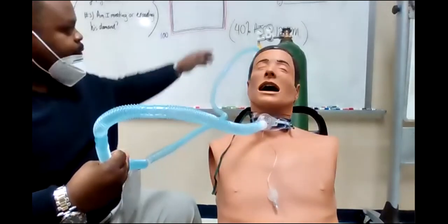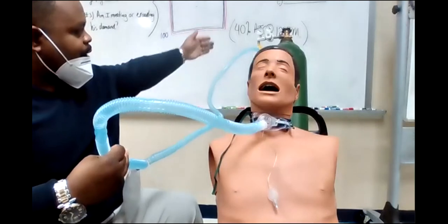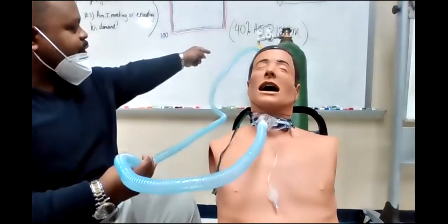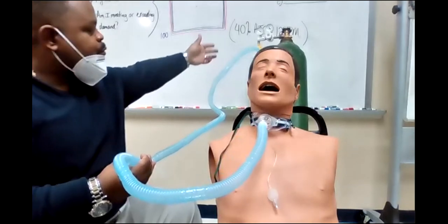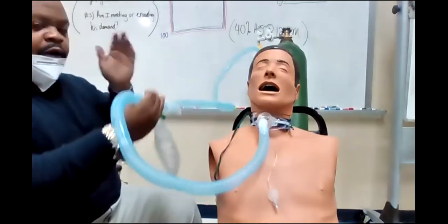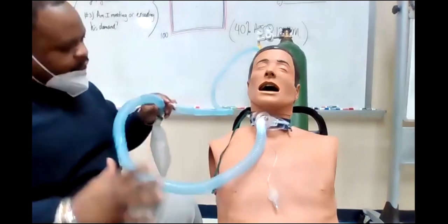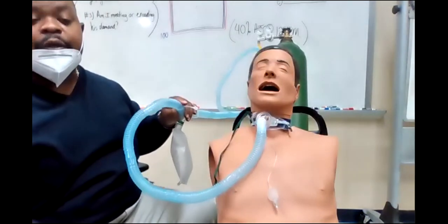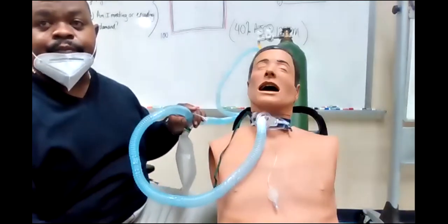Set it up. Start from the machine all the way down to your patient. You have your large volume nebulizer, which has the water, one large bore tubing, a reservoir bag, another large bore tubing, and then whatever it is you're gonna have them on. That's what you gotta be able to do in lab, okay?